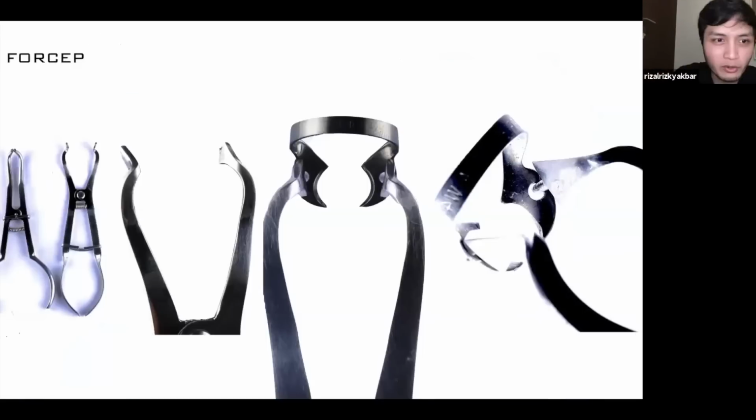This one is forceps. So forceps, there's two types of forceps, but I really like the one that I show you in the picture. It comes with the, you can see here, like an undercut, to hold the clamp and then to place it perfectly on the tooth.